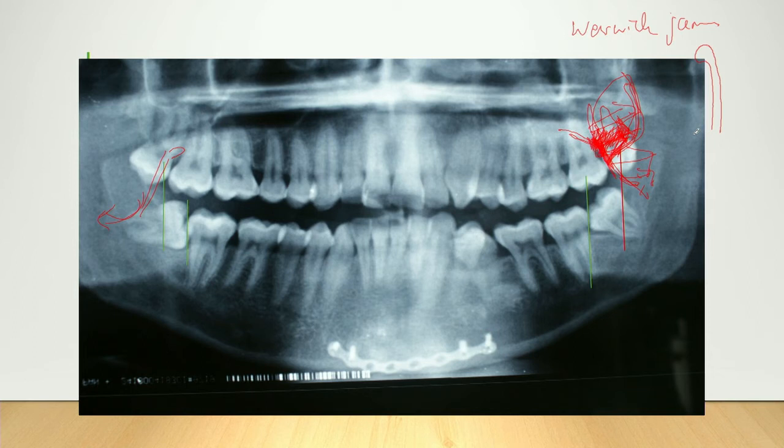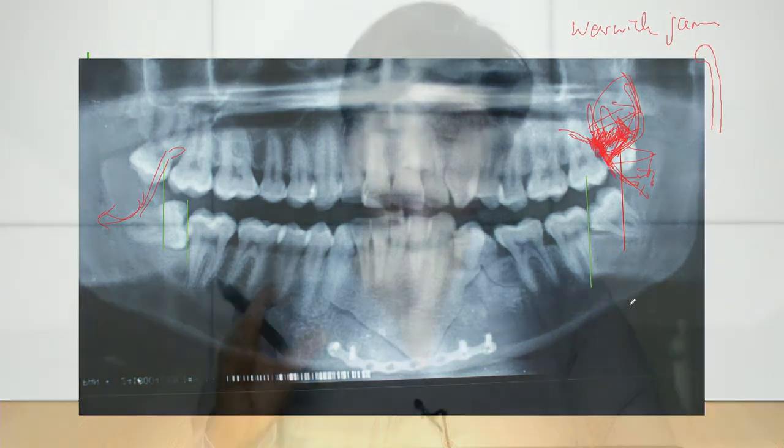Don't keep on going. If you feel that you can manage the situation, and you want to remove the tooth without taking out most of the tuberosity, I'll peel the periosteum palatally and buccally off the tooth so that you can remove the tooth with the buccal bone, hopefully with not too much palatal bone and not too much distal bone, and you still have that soft tissue that you can then close with. You've got to have quite a lot of experience to deal with something like that.